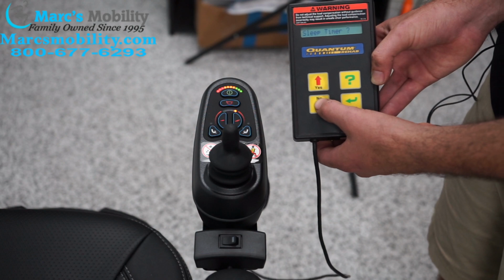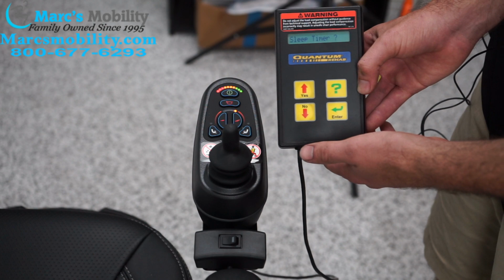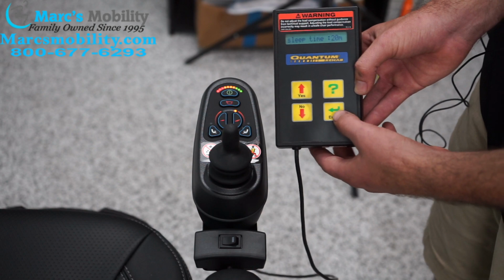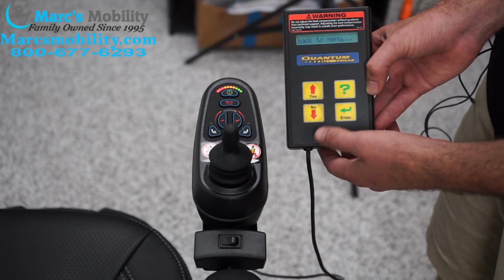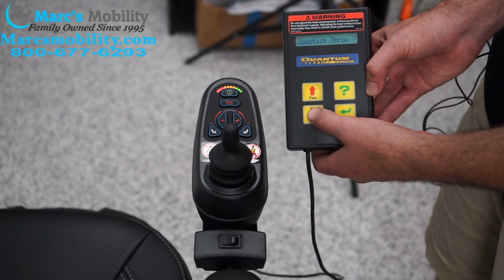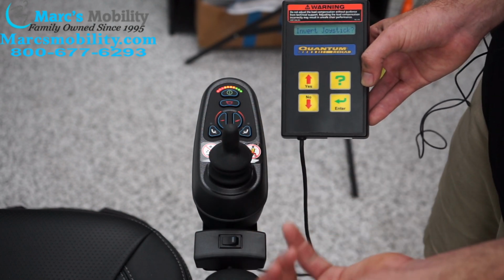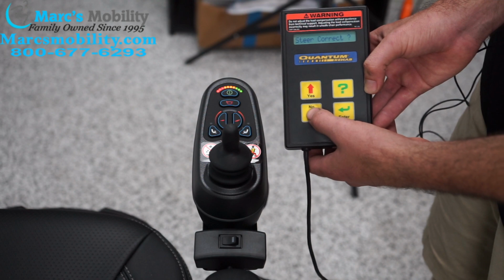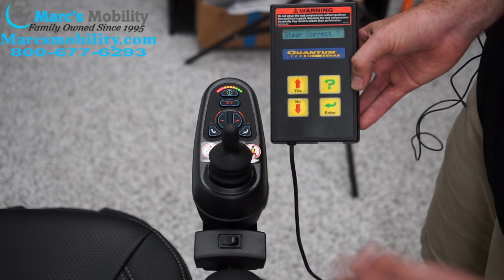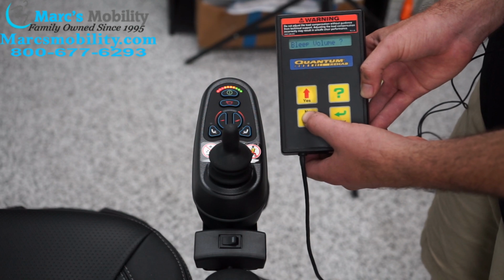So beyond profile 5, we have sleep timer, which is how long for the chair to turn off automatically when not being used. It should be set to 20 minutes currently. If I want to edit that, yep, there it is, 20 minutes. Joystick throw is how sensitive the joystick is. You shouldn't need to edit this. Invert joystick will make forward backward and backward forward. Again, you shouldn't need this. Steer correct is if a motor is going bad and is pulling to one side, you can compensate that. Bleep volume is how loud the horn is.